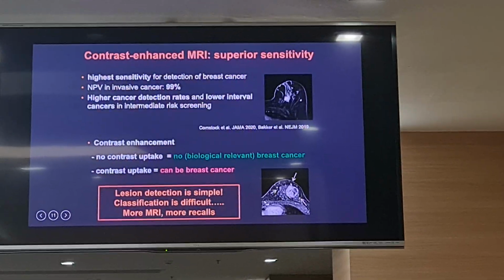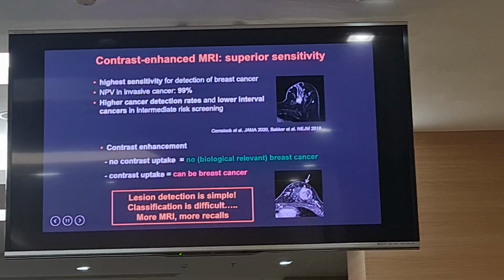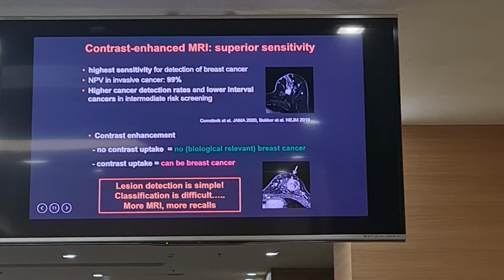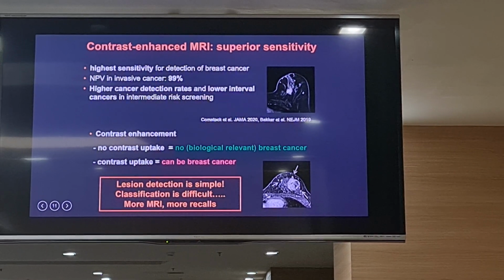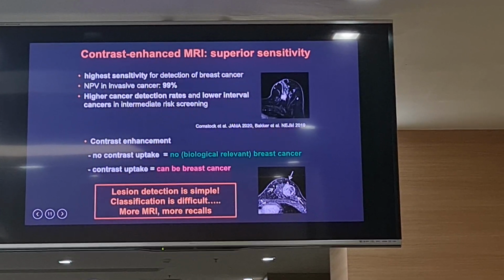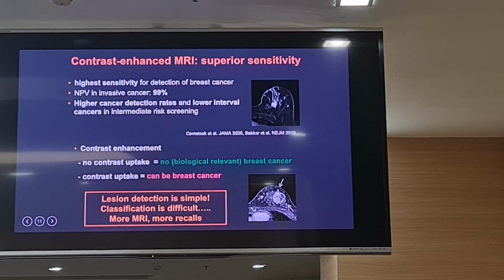We can identify the lesion, but the next step is the characterization of the lesion. Is it malignant, or what is the subtype of the breast lesion? Breast radiologists face many challenges so far. Based on the shape, morphology and kinetics, we have the likelihood category: category 4, 5, 6, we recommend biopsy, and category 3 to 1, follow up or no further exam. But this is mainly not based on a decision tree strategy, so this is still not established, in my understanding. So classification is really challenging.